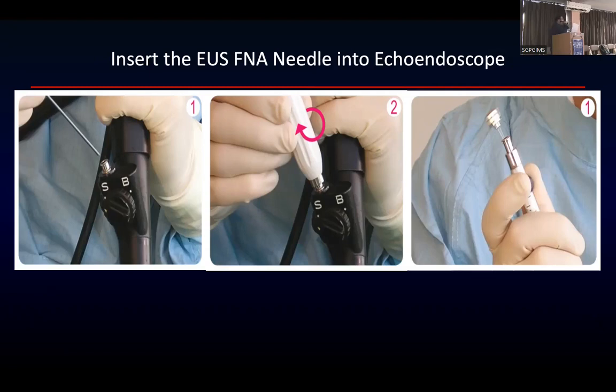This was the concept with which this was made. I think recently I was in some meeting and there this stilet was made possibly by Peter Vilmann, and he was there in the meeting. But now there are many studies which tell you that stilet is not required. This is what many studies tell you now. You do with or without stilet, it does not matter. But this was the pretext based on which stilet was introduced. Okay.